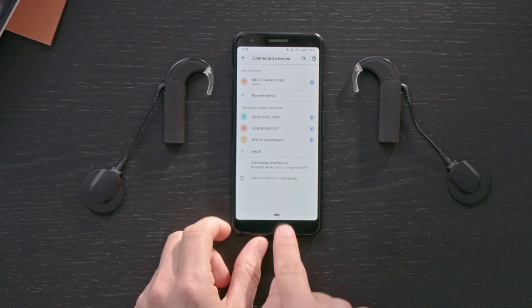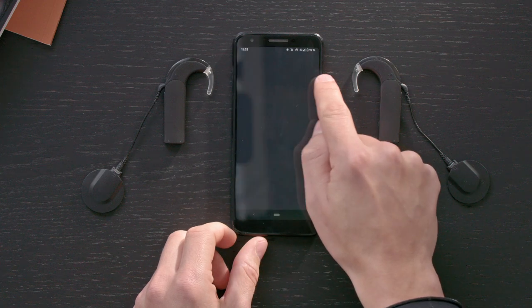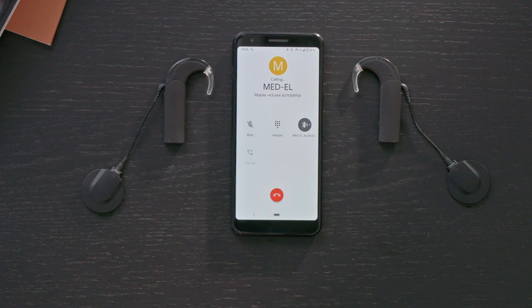To start a phone call, proceed as you normally would on your mobile phone. The sound from your phone call will be automatically streamed to your audio processor. Speak into your phone's microphone once your conversation partner answers.